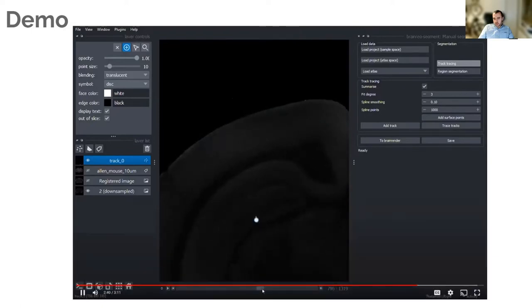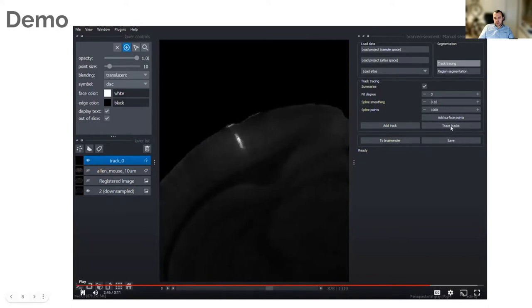Once you've got to the end, double-check—you can add more points if you need. There's a few parameters to choose. Basically what the trace track button we're going to press here does is it will connect the dots essentially using some linear or non-linear fit. And then all you really need to choose is how many points you want this fit to be.